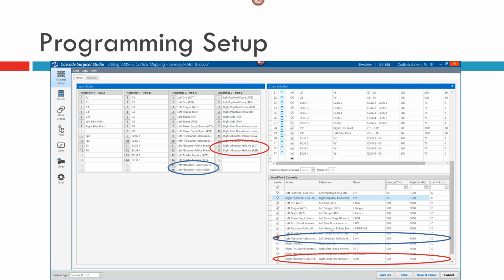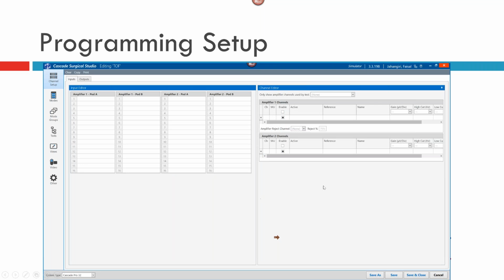So how do you write that program? Just starting off with a simple train of 4 program. If you open any new program file, you'll see a blank screen, and there'll be nothing there.